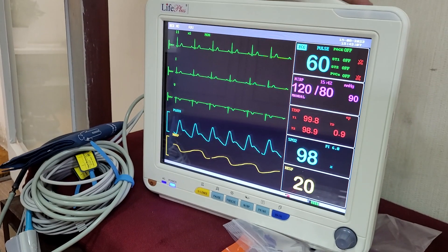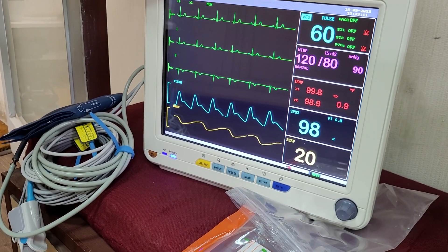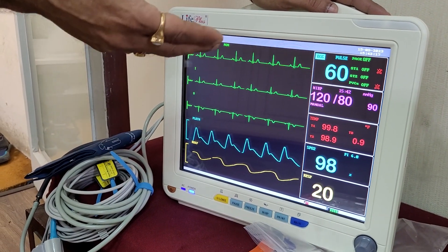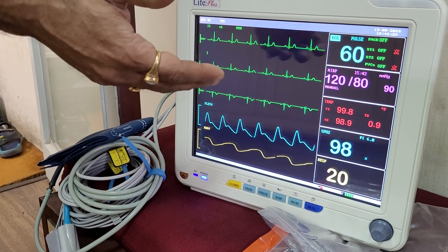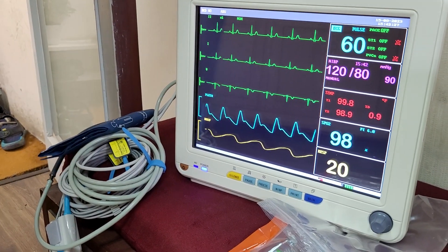We can use it anywhere — at the bedside, OPT, clinic, anywhere. Another monitor we have which you can connect EtCO2 to IBP — the model is the LPM 904. So in the next episode, we can show you the video of LPM 904. Thank you so much.